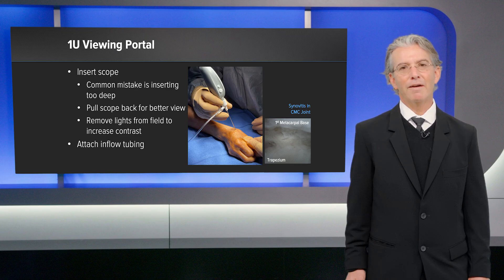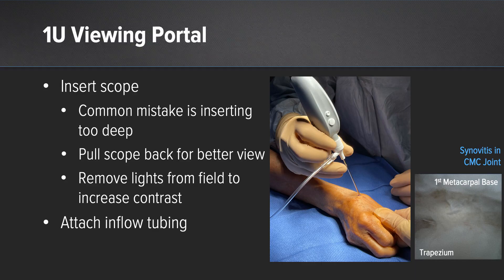Viewing of the scope can be achieved by putting the nanoscope through the 1U portal. Care is taken not to put the scope in too deep, as this is a common mistake. Gently pull back on the scope to visualize the dorsum of the CMC joint. Turn off the overhead lights in order to improve the visibility of the screen, and then attach the tubing for fluid.